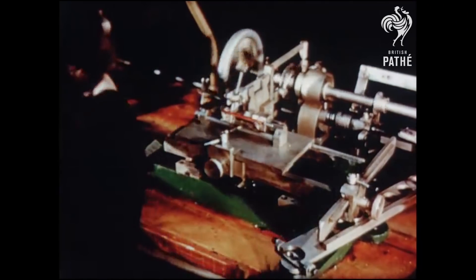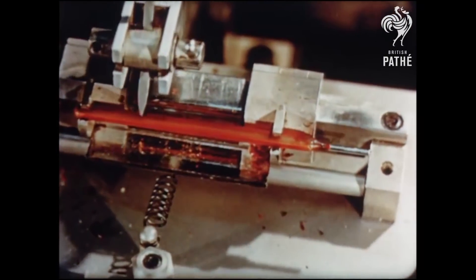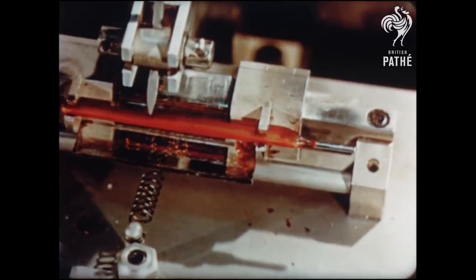Tests for accuracy have to be applied, but the thermometers are ready now to be popped into millions of mouths throughout the world — the handiest weapon in the fight for health.